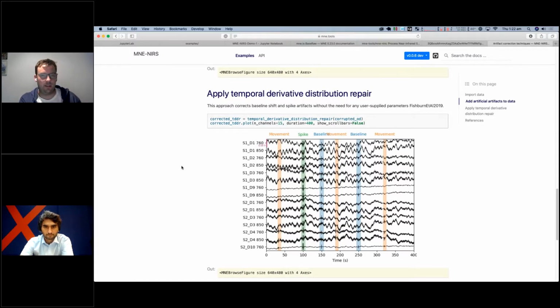The benefit is everything is checked, and there are tests for everything. We normally have what we call a development version, which is cutting edge, and that's what this question is about. This person knows that reading this data is available in the cutting edge branch, but it's not yet been released.